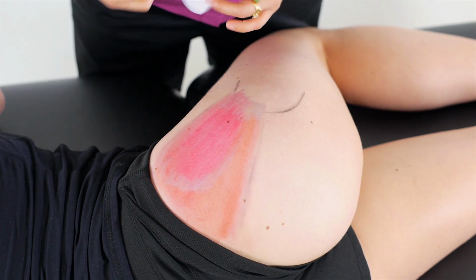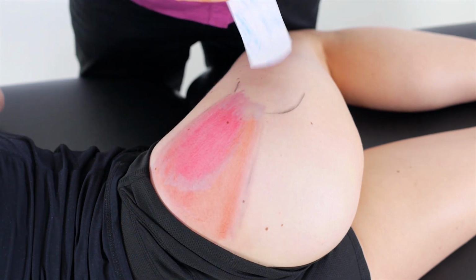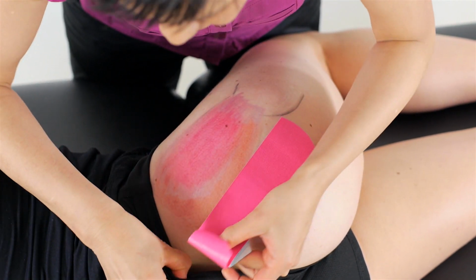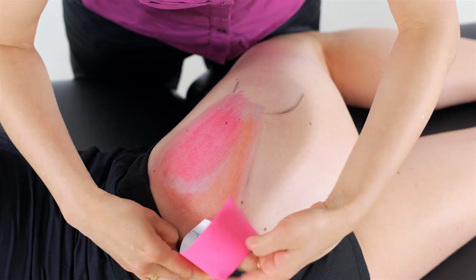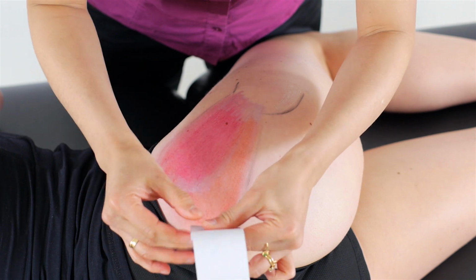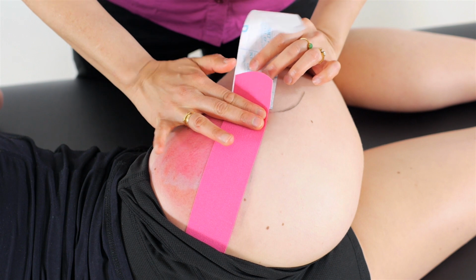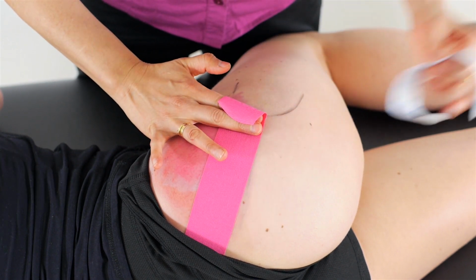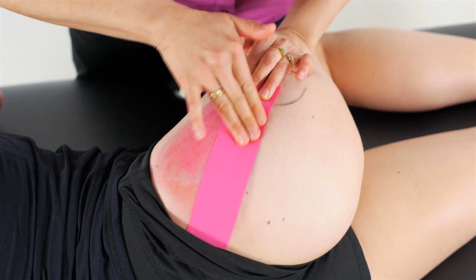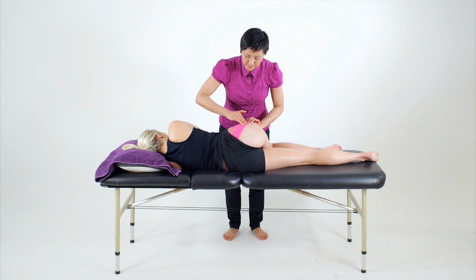From there, we measure a length of tape from the posterior ilium over to the greater trochanter. We start our tape by removing the tape off the backing and let it settle to 0, and starting our tape on the posterior ilium. From there, we pull back the tape to the final anchor, stretch it out with 25 to 35% tension before letting the final anchor rest to 0 and then placing that on the greater trochanter. Rub the tape to activate the glue.